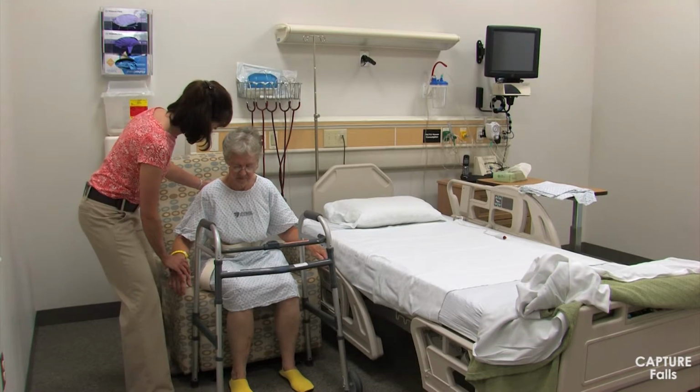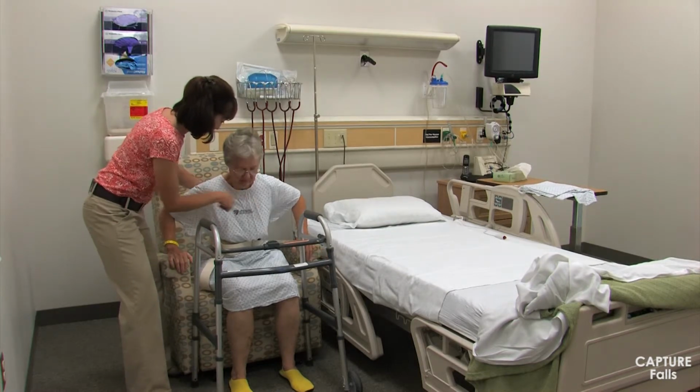Next, to help the individual stand, have her place both hands on the armrest of the chair. She can reach for the hand grips of the walker as she assumes the standing position. Position yourself along the side of the patient, opposite the bed, so you are not in the way as the patient turns. You should hold onto the gait belt with the palm of your hand facing up. Instruct the patient to lean her trunk slightly forward and to push through her arms and feet to stand.